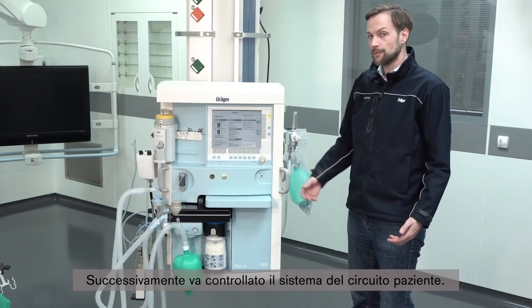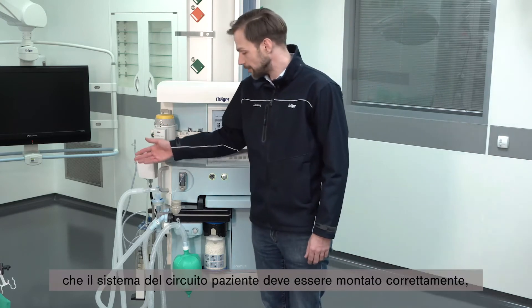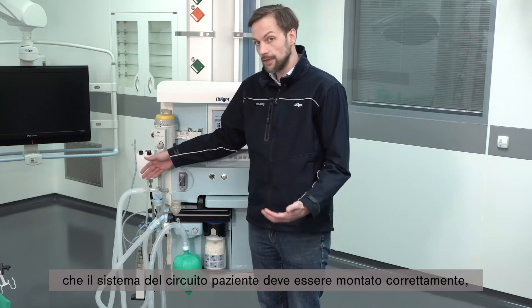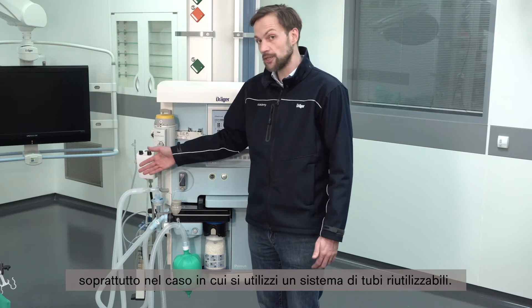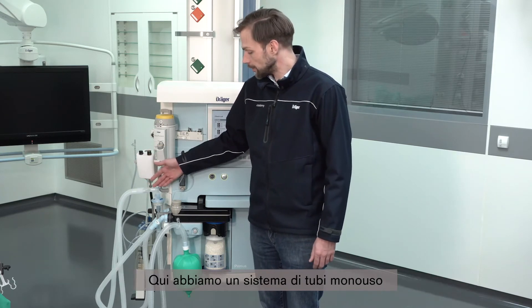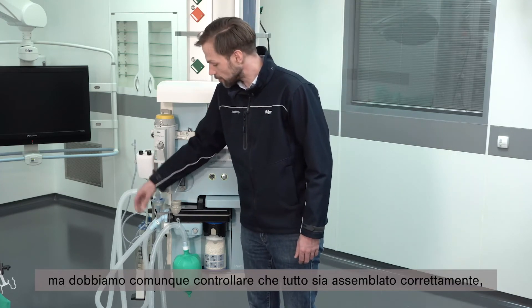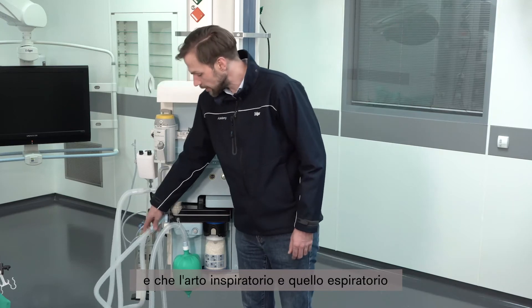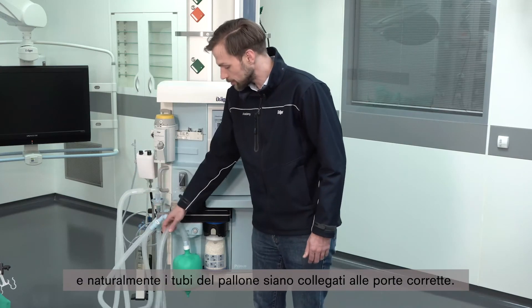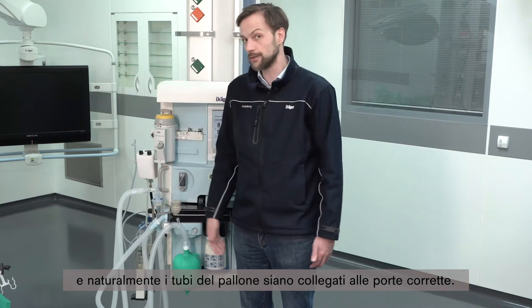Next in line is the breathing circuit system. It is very important to confirm that the breathing circuit system is assembled correctly, especially if you are using a reusable hose system. Here we have a disposable hose system, and we still have to check if this is all assembled correctly — the inspiratory and expiratory limb and the handbag hose system are connected to the correct ports.